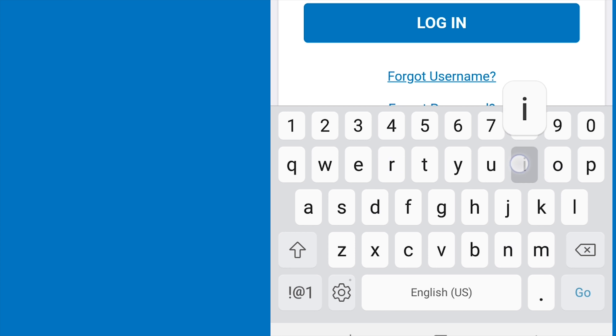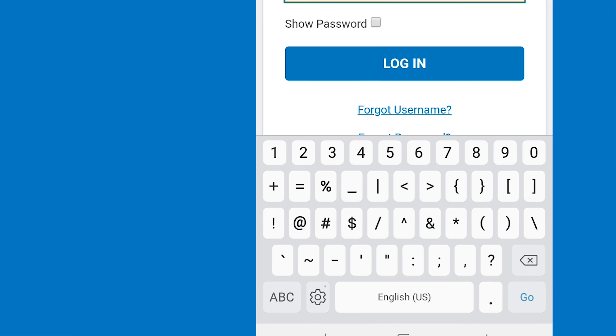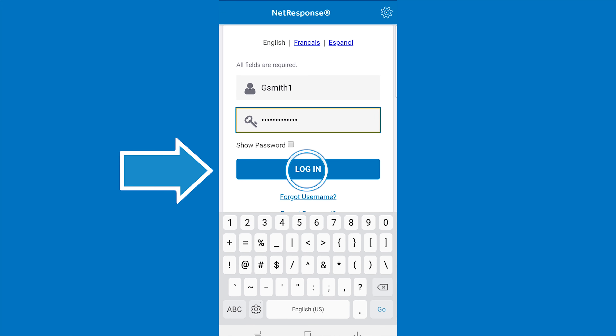To enter the exclamation mark, press the SIM sign and then the exclamation mark symbol. Next, click login and wait for the next screen to load.